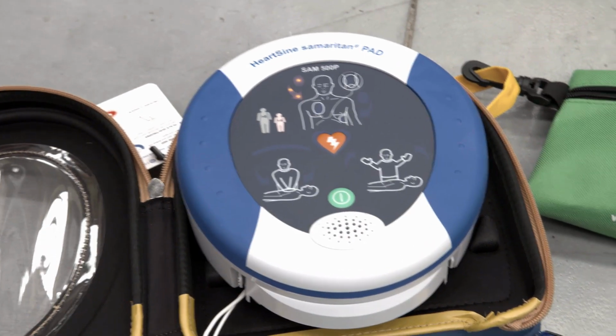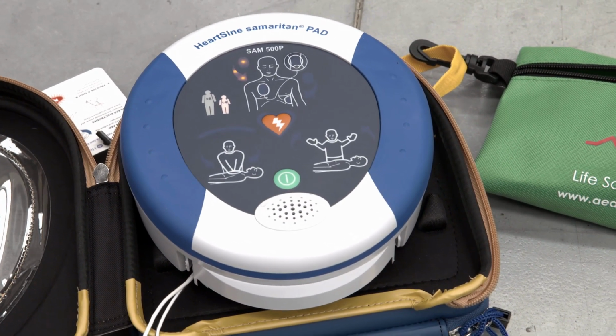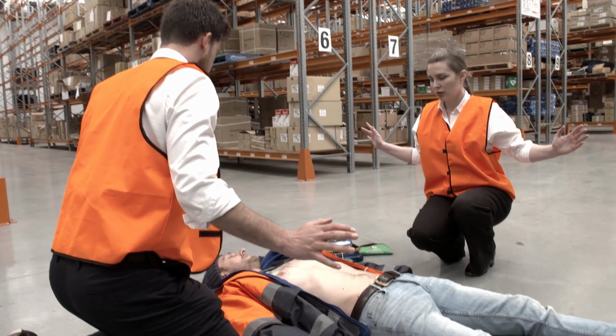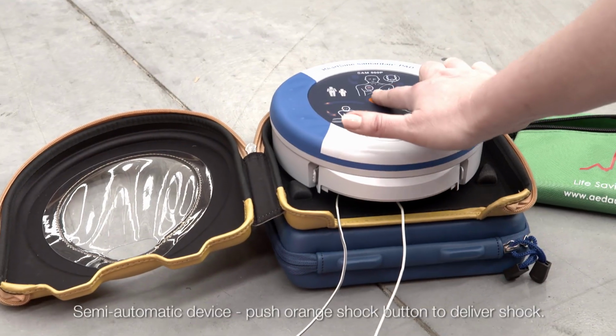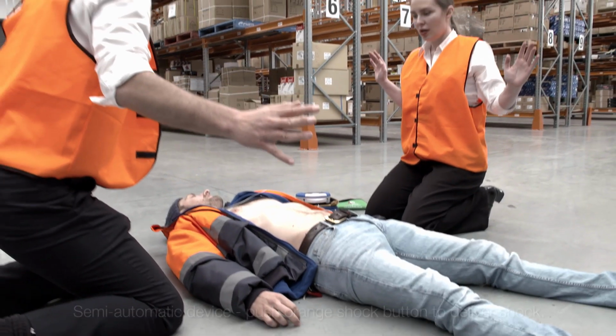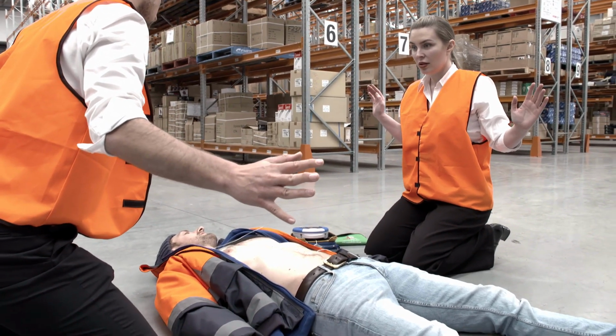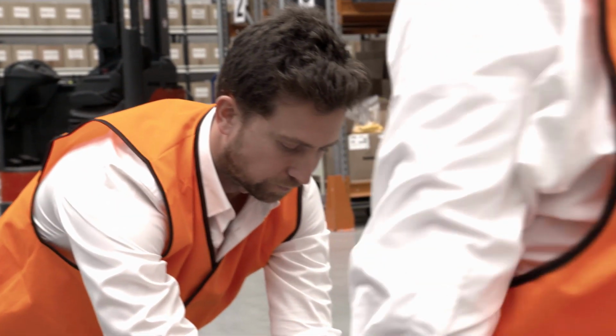Analyzing. Do not touch the patient. Shock advised. Stand clear of patient. Press the orange shock button now. Shock delivered. It is safe to touch the patient.